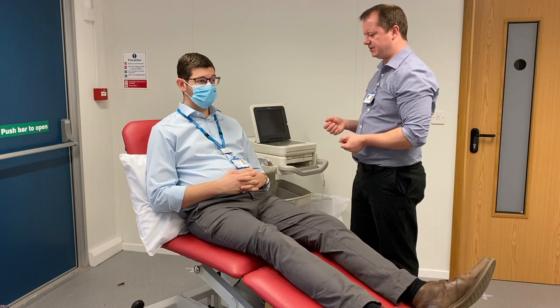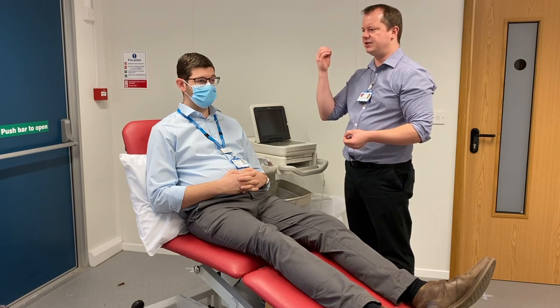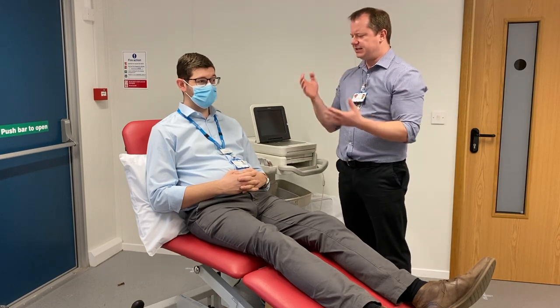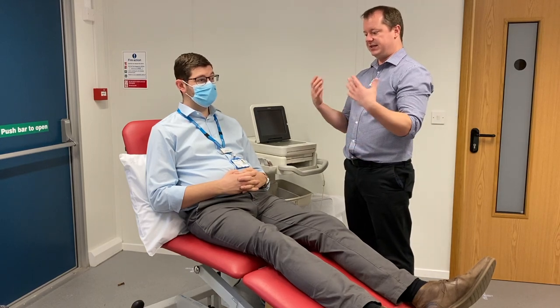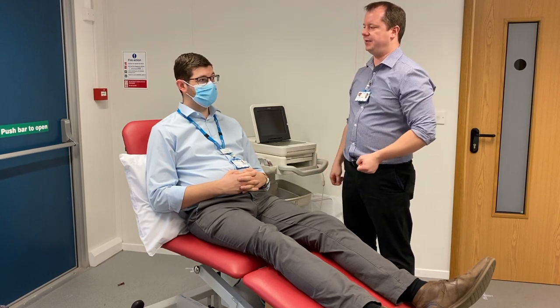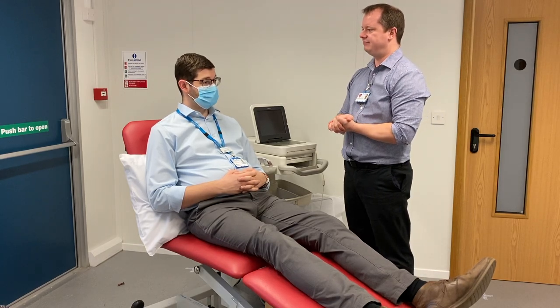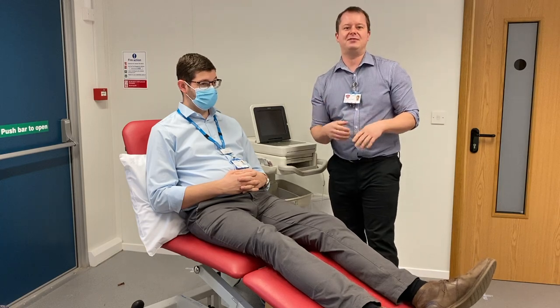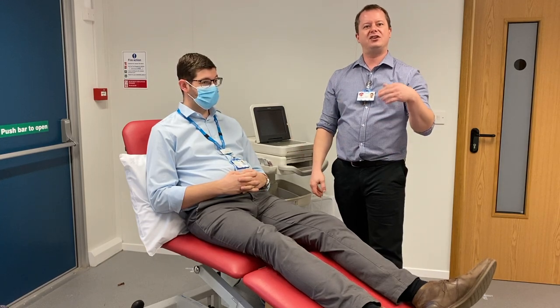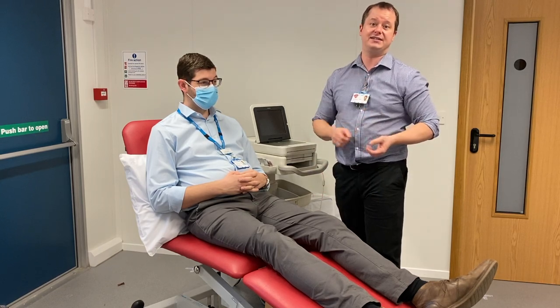If we are going to be performing this test on the patient, we need to do all the things that we normally do for every single practical procedure — make sure that we introduce ourselves, say what our role is, say why we're there, and then get consent from the patient. So: 'Hello, my name's Tom, I'm a nurse, I'm here to do an ECG.' James has agreed to that.